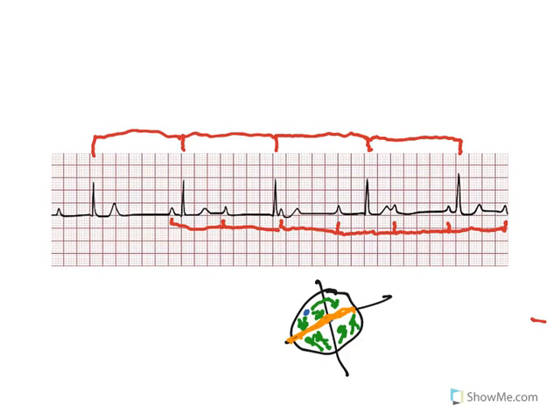The QRS complexes are doing their own thing, and the P waves are doing their own thing. And that is indicative of third degree. Don't look at the QRS and think, well, it's wide, so it must be a third degree. Again, people will tell you that. They're wrong. That's complete hogwash.